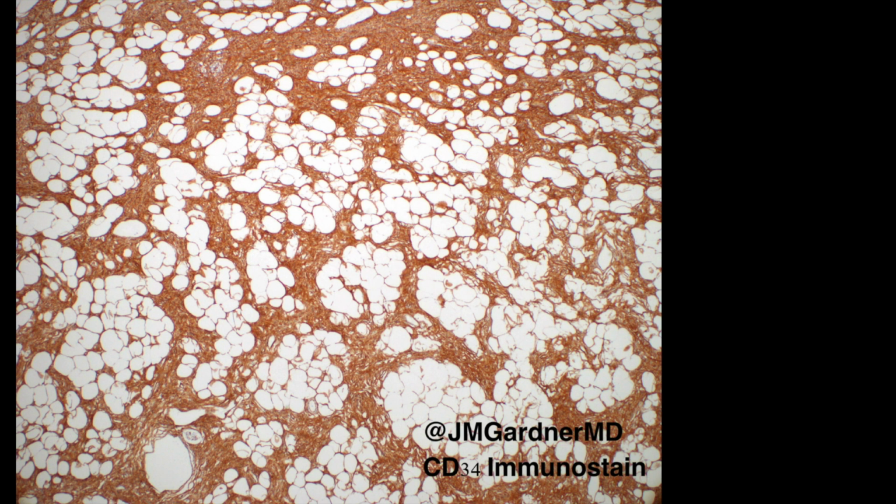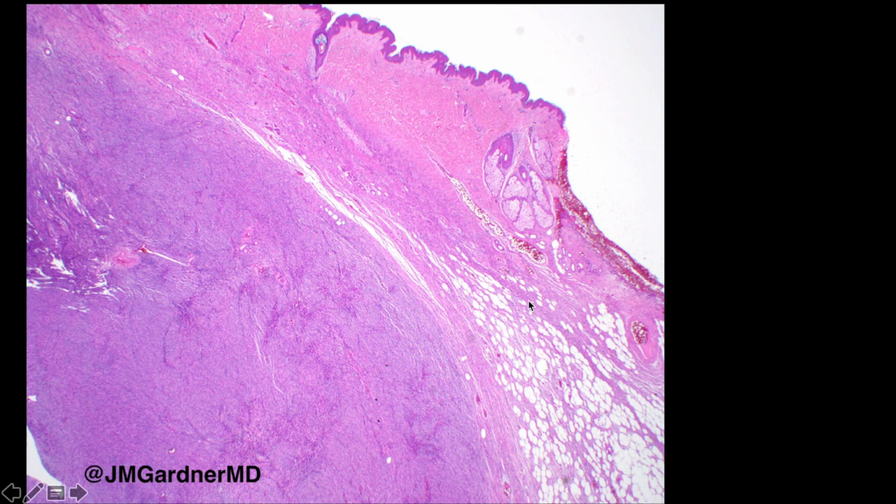CD34 is a very sensitive stain that's going to be positive in the vast majority of conventional DFSPs. But it is not, of course, specific at all. It stains lots of different fibroblastic and myofibroblastic entities, and also can stain things like spindle cell lipoma, which can sometimes overlap morphologically with DFSP. So very helpful as a screening tool, but make sure that you don't let CD34 lead you astray. It stains many different things. Sensitive, but not specific.